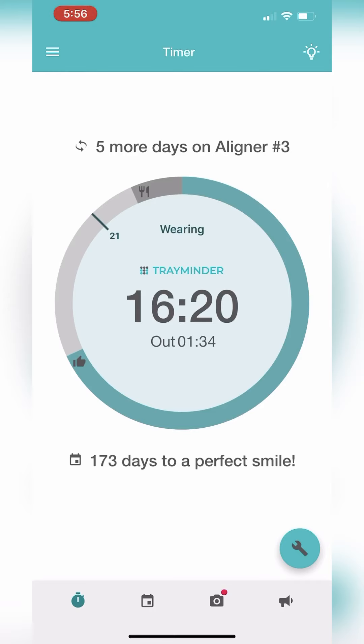The outer ring is like a pie chart of your in and out times. The teal part of the ring with the thumbs up shows you at a glance the amount of time you were wearing your trays for the day. The dark gray part of the ring with a fork and knife shows you how long your trays were out. Your goal is for the teal part to reach the tick mark, which is the daily wear goal you have set.